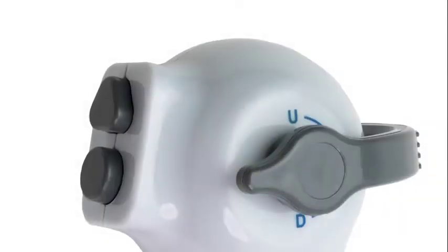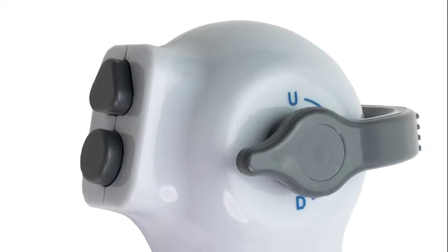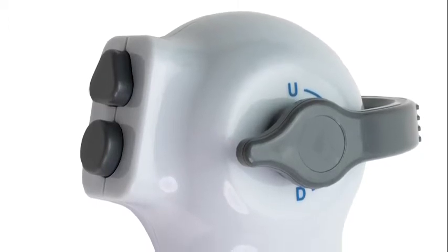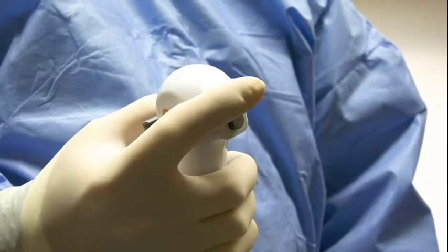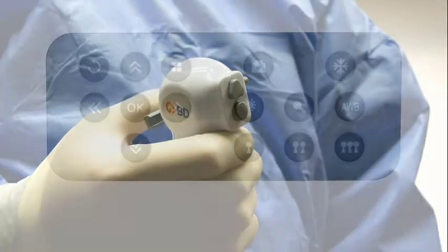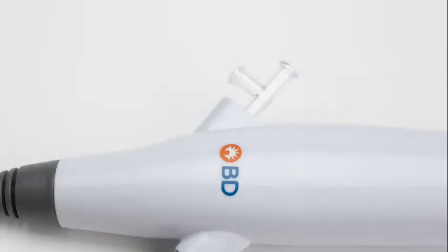On the handle are two customizable buttons that can be programmed to any of the key functionalities for visualization, such as photo and video, auto white balance, zoom, freeze, and LED brightness adjustment. In addition, up to three unique user profiles can be stored on the BD-APTRA image system. Centered on the handle are two ports that provide access to the single working channel of the scope. One port accepts surgical accessories, while the other provides a connection point for irrigation.